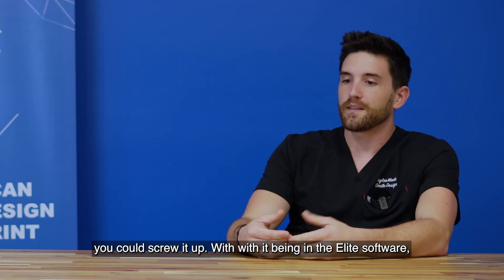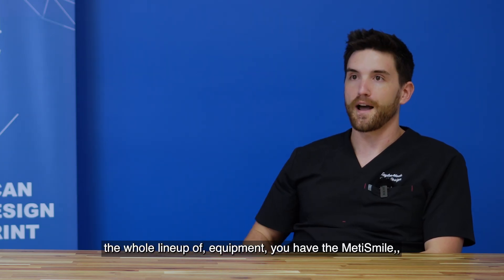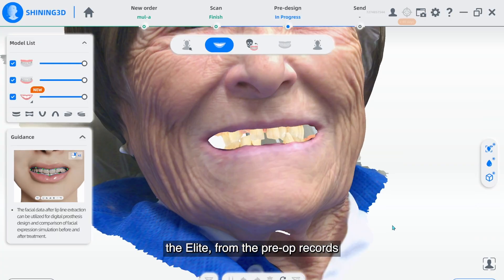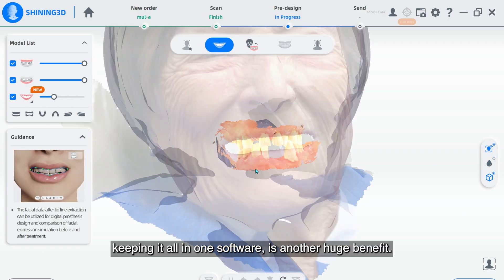With it being in the Elite software, it puts that task in the hands of the user. And if you have the whole lineup of equipment — you have the MediSmile, the Elite — from pre-op records to surgery records to post-op records, keeping it all in one software is another huge benefit.